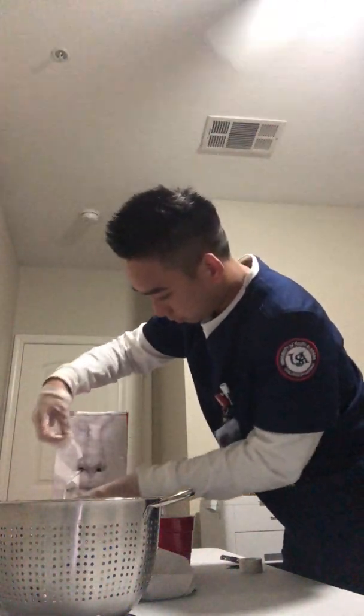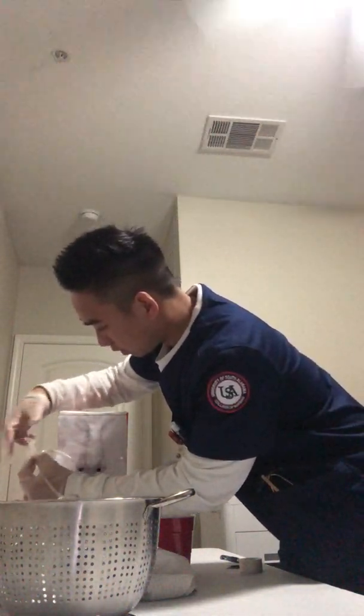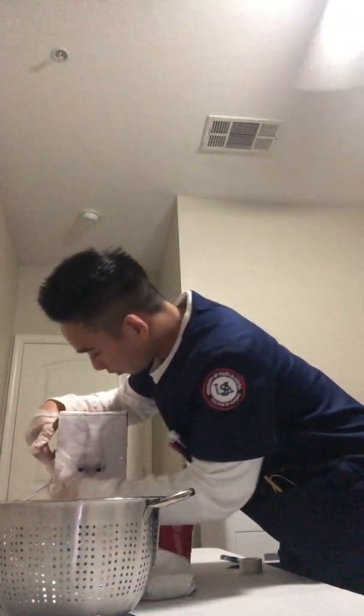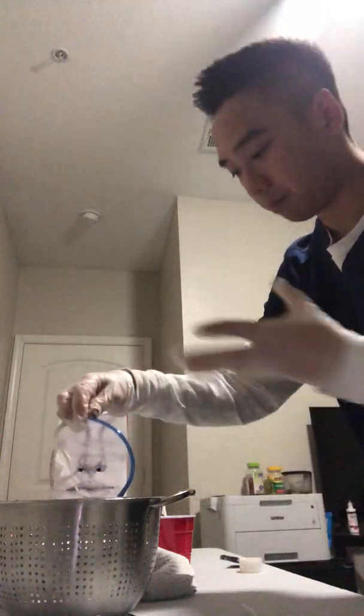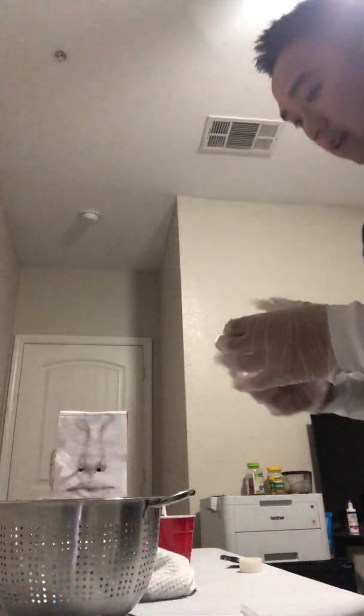So now I'm going to take my tape that I had secured, and secure it to the cheek temporarily, like so. Then I would take my piston tip syringe and connect it in here. So it's connected, and then I would aspirate.